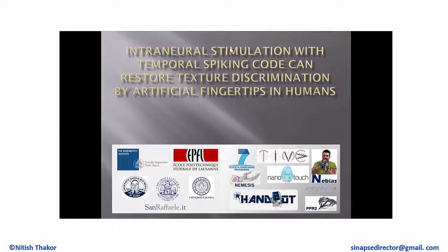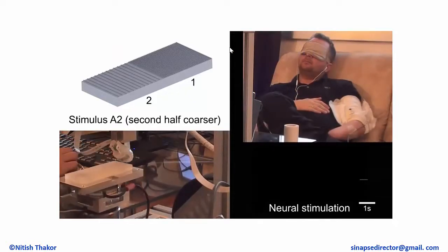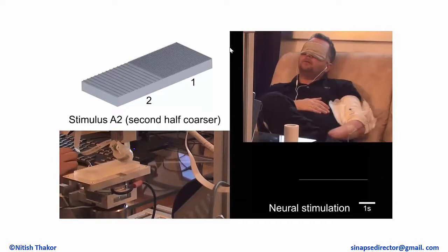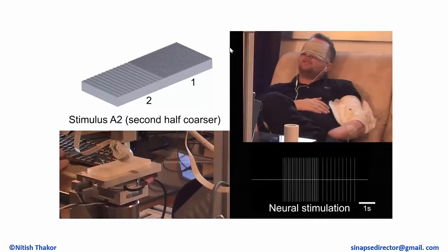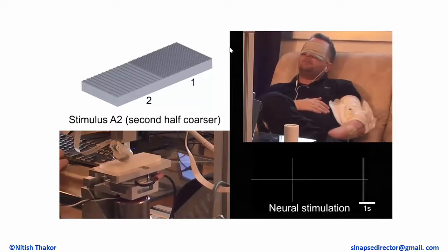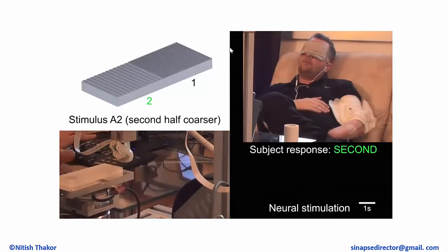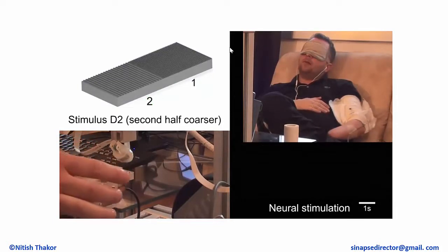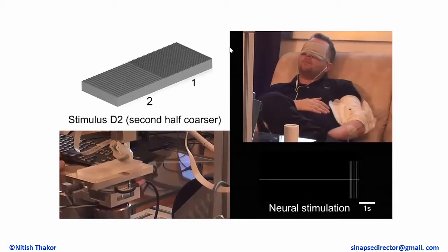There's also some ongoing work elsewhere. For example, at EPFL, they are experimenting with implanting this into the nerves of an amputee. So this amputee on the upper right, and you can see on the lower left is an artificial finger, and it's looking at different types of textures. And in the lower right-hand corner is this nerve stimulation, and then he's able to say, based on the stimulation pattern, whether it's a rough or smooth object. Only very small classes, but it's kind of interesting because now the signal goes directly to the nerves. So he can predict whether the object is rough or smooth.